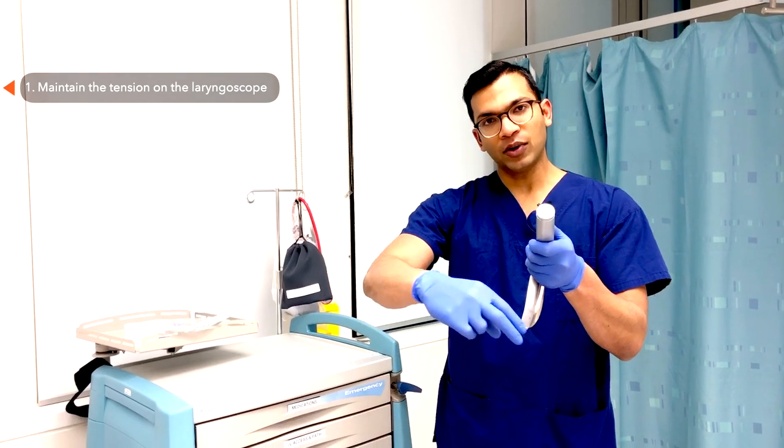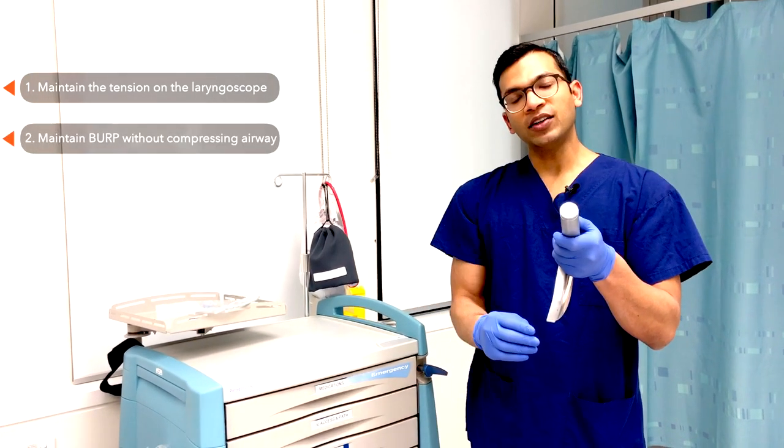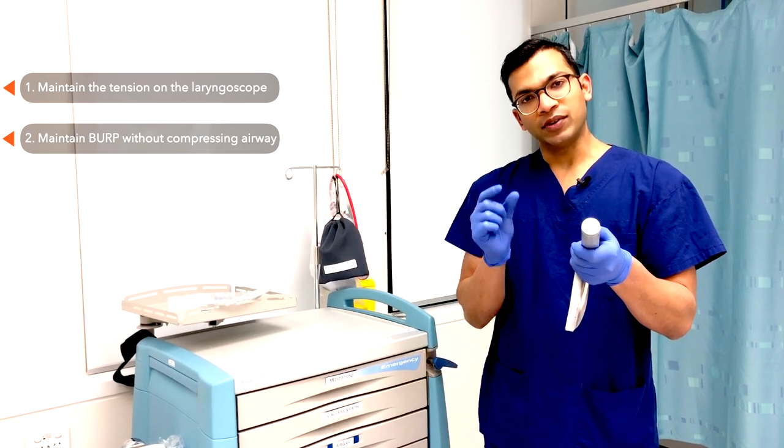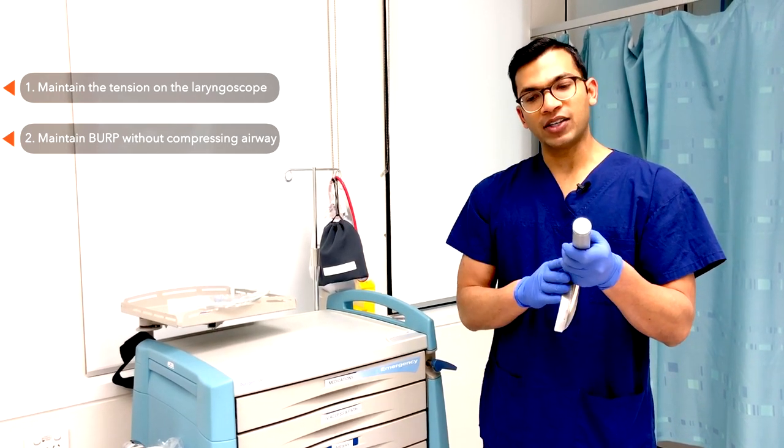If you have BURP on, I'm going to make sure that that's also held, but make sure that your assistant doesn't squeeze the larynx too hard or at all, because that will narrow the aperture that your tube is going to pass over.